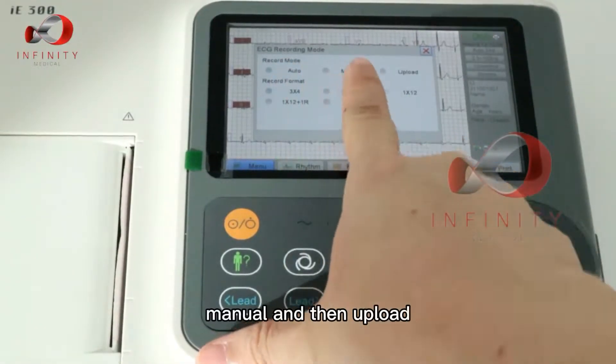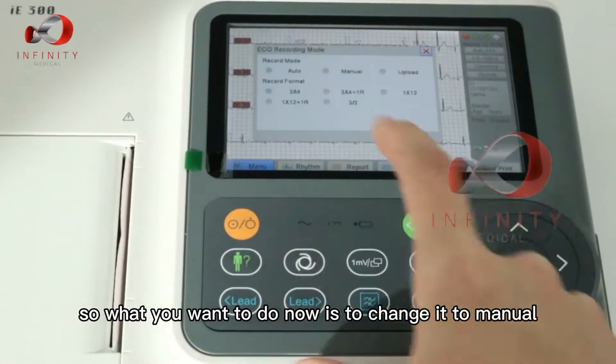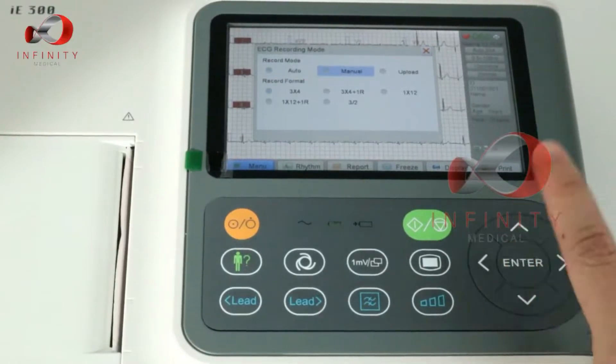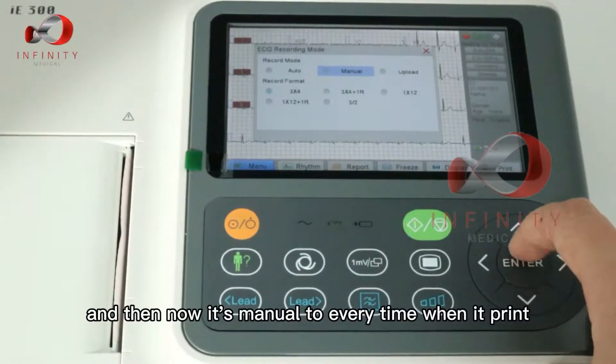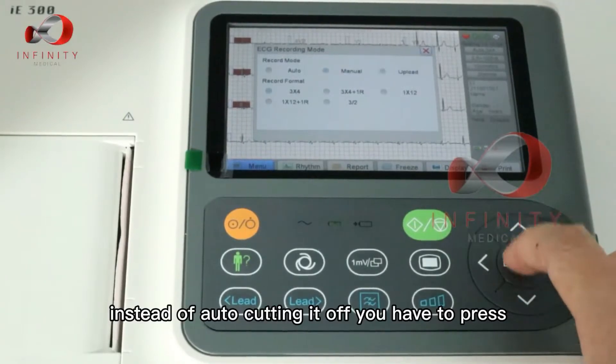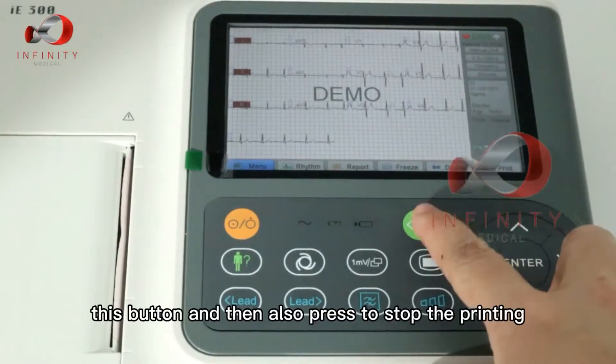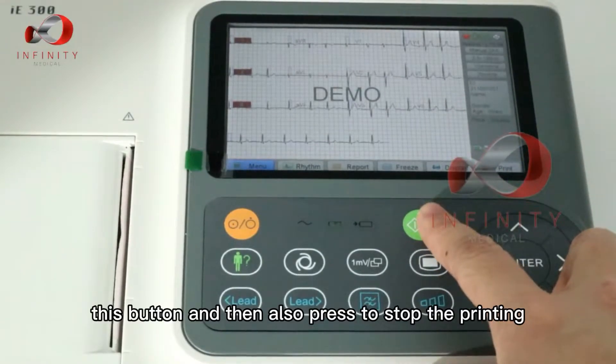You can see here there's auto, manual, and upload. To change to manual mode, press the button and select manual. Now it's in manual mode, so every time you print, instead of auto cutting it off, you have to press to start the printing and also press to stop the printing.